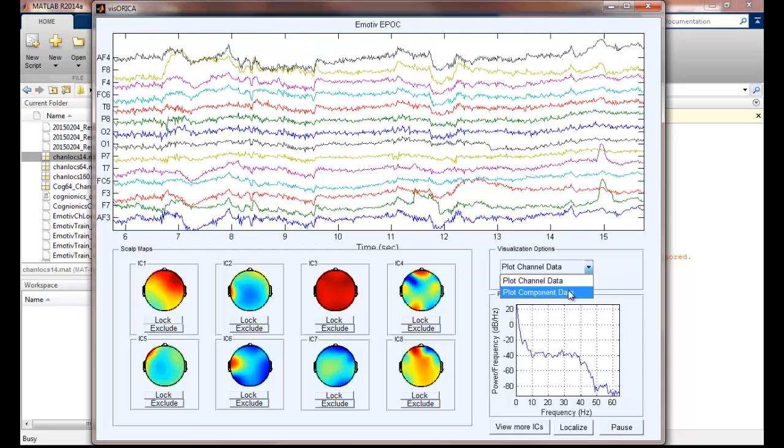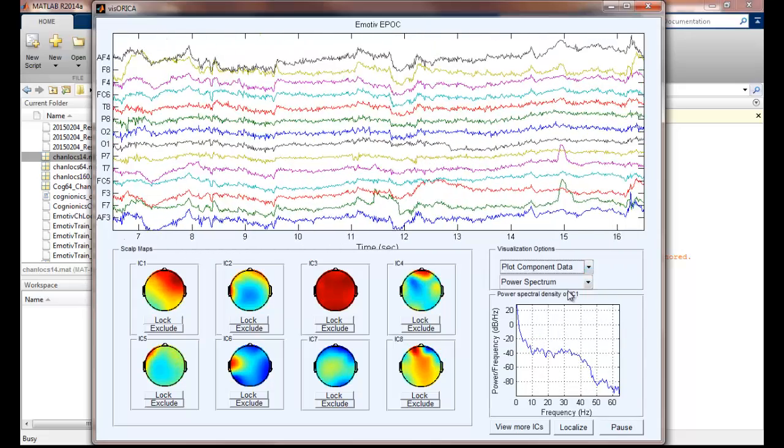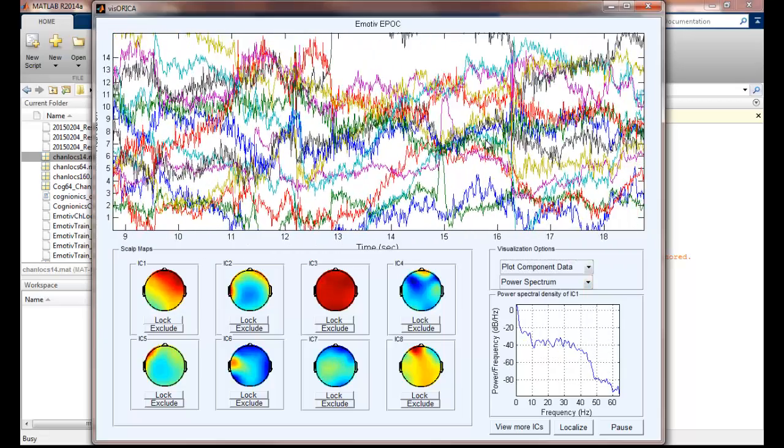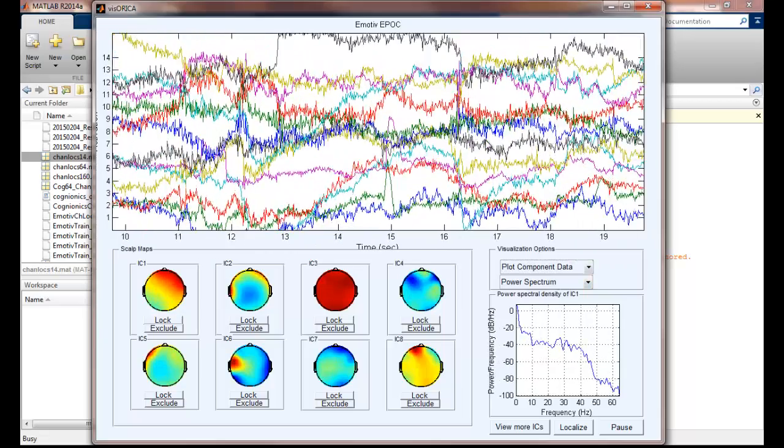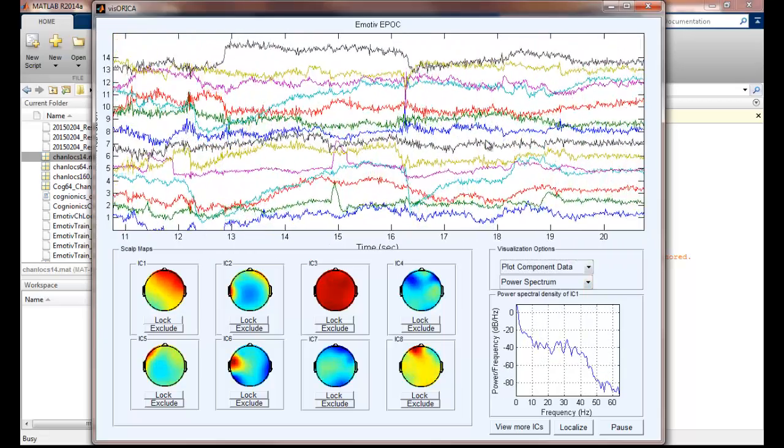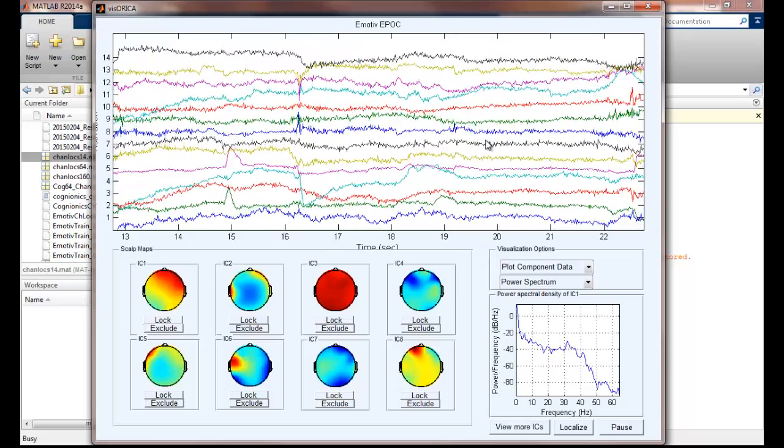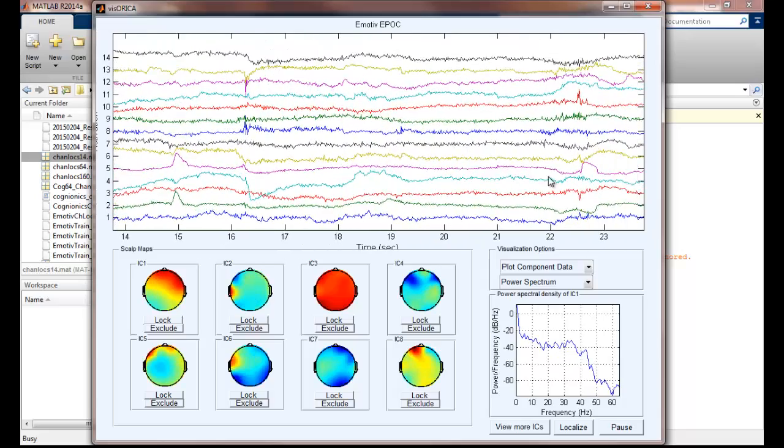We can also select component data to visualize the time series of the source activations, which is basically the temporal activities of each independent component.